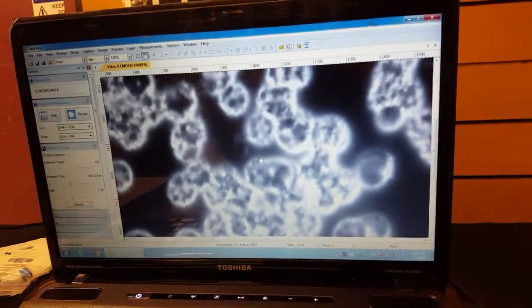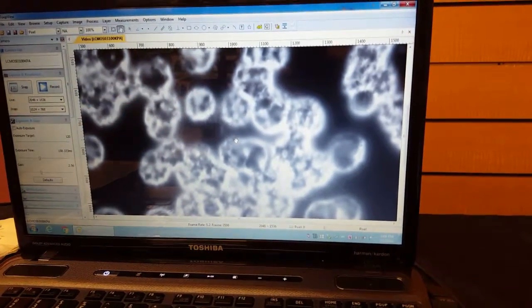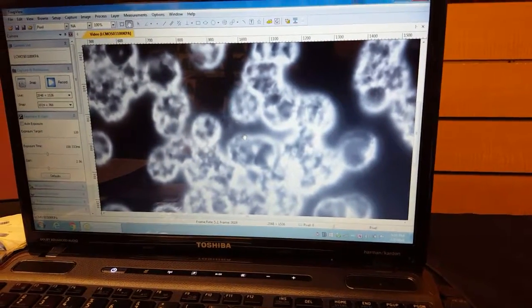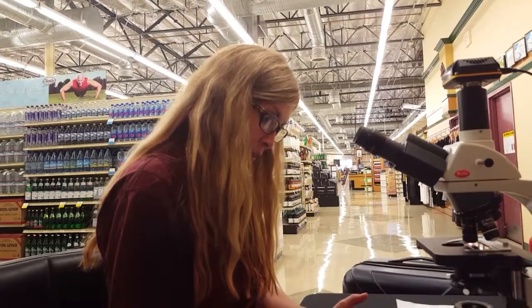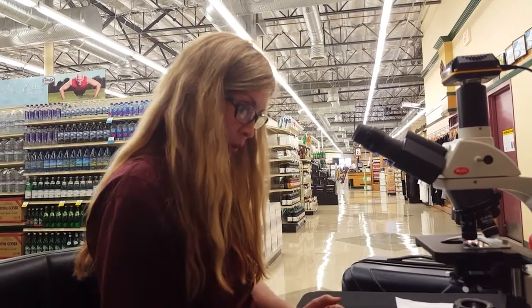I don't see any crystals, which means I don't see any real big anti-inflammatory things going on there, crystallizing anything red or anything. So I don't see any of that. So you're good there. You're a 1 there. Your platelets are clumped, so I'm going to give you a 5 again. I didn't see any bacterial levels. You're really good there.